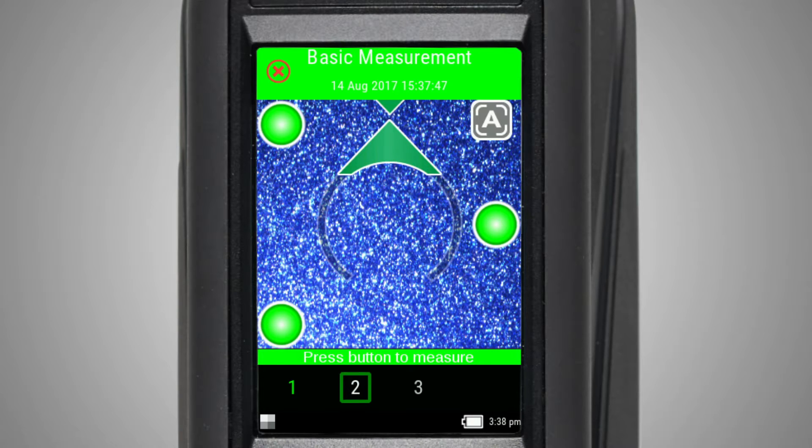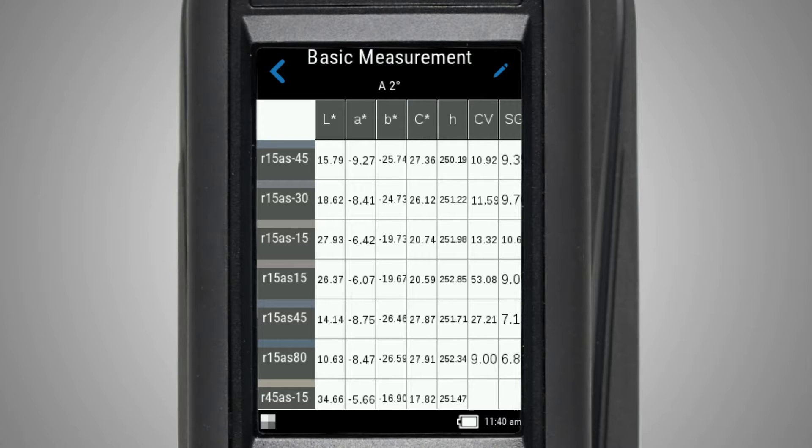If averaging is turned on in your instrument settings, you will see the current measurement down here. Continue with the remaining measurements. Once finished, the results will be displayed.